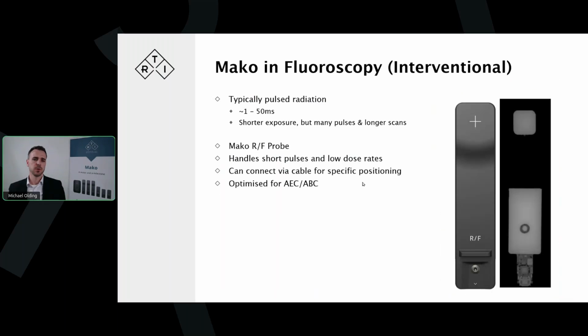The design of the probe has also been optimized for what we call automated exposure control or brightness control. And that means that the systems themselves will automatically detect the density within the image, and they will adjust the settings or the dose output based on the density that is seen within the image. So we don't want something very dense in the image when we're doing our testing.